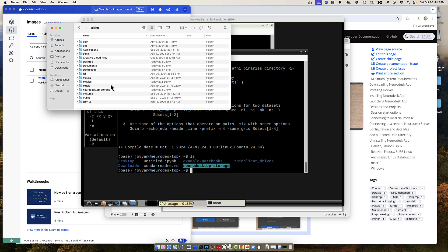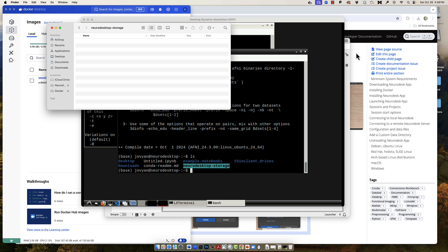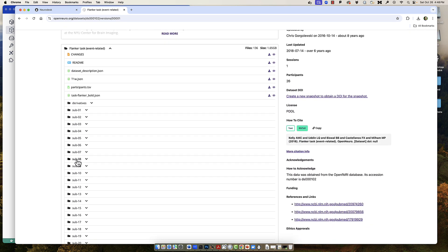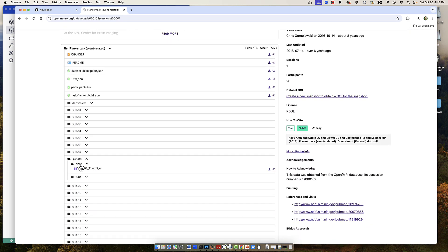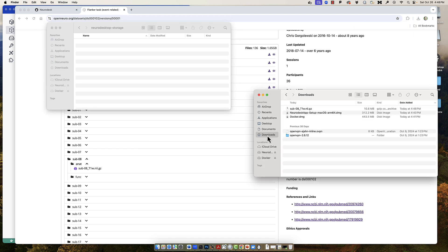Anything placed in the neuro-desktop-storage folder on your local machine will be accessible in the virtual desktop, and vice versa. For example, if we go to a website like openneuro.org and select the Flanker dataset, and download a sample image such as a subject's T1-weighted anatomical image, you can place it from your downloads folder into the neuro-desktop-storage folder from your local machine.